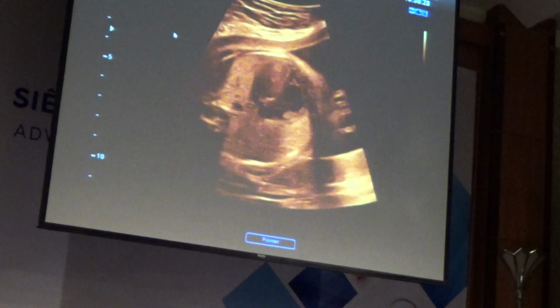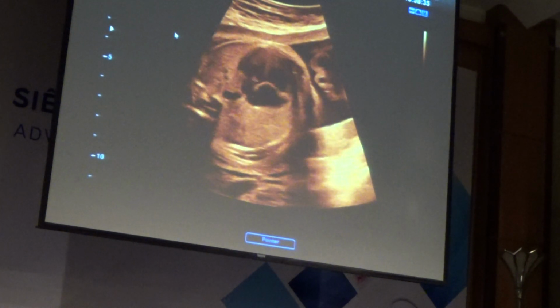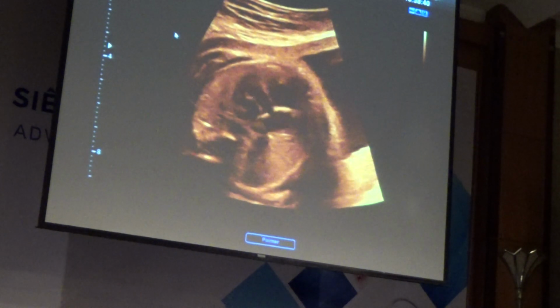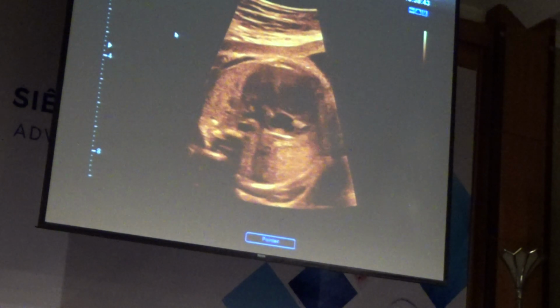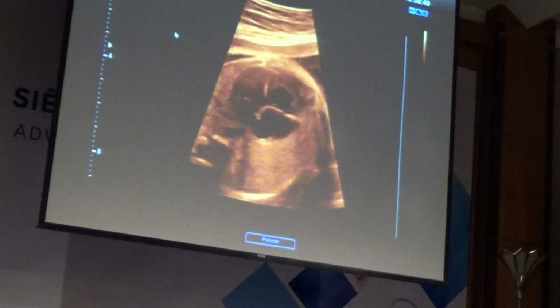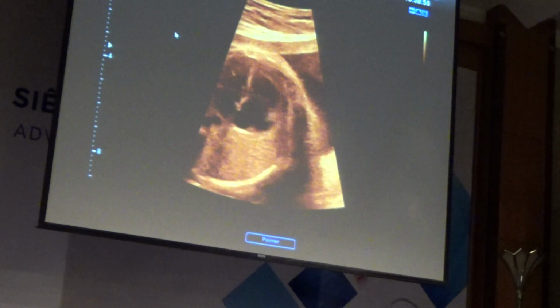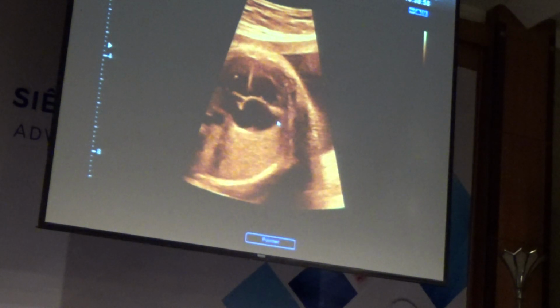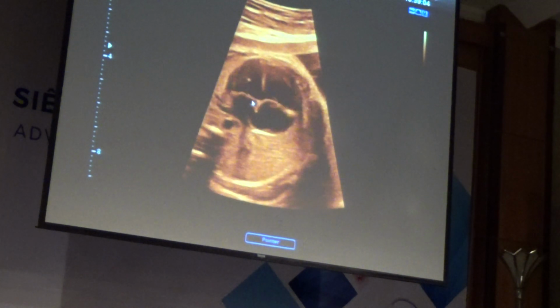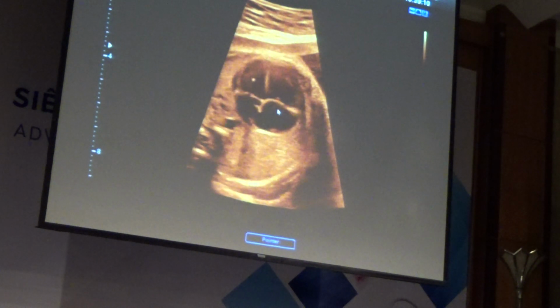So now it depends what we want to look at. Again, there's many things to see on the 4-chamber view. I'm going to change the depth. And now I'm going to change the scan area. So we have a very high resolution imaging now. Beautiful, we're seeing beautiful imaging of the tricuspid valve, the mitral valve. See, I'm doing them one at a time. Mitral valve, tricuspid valve.